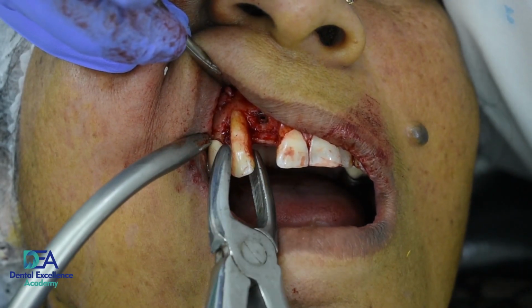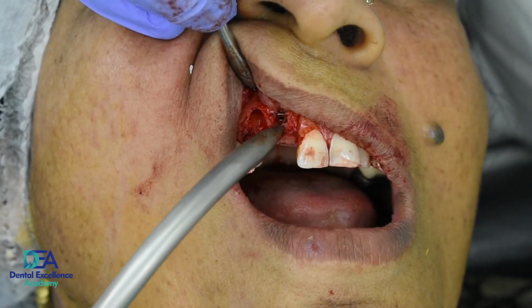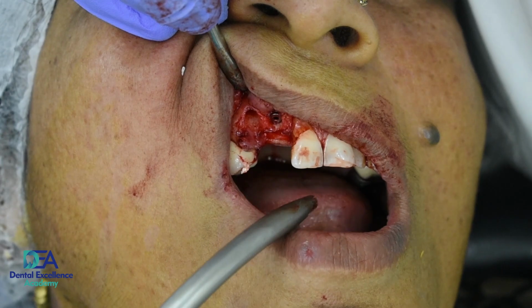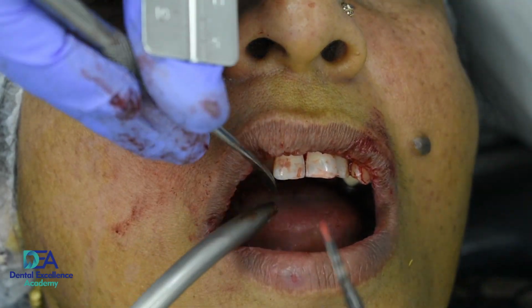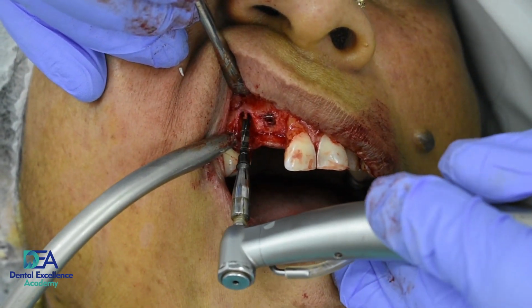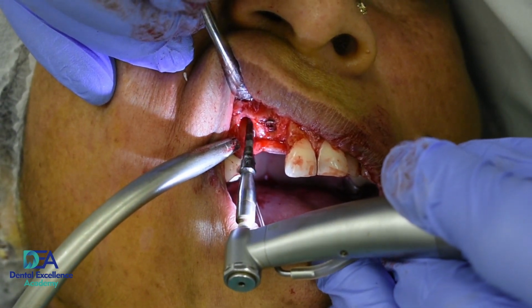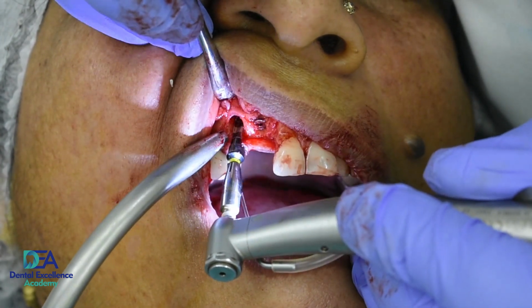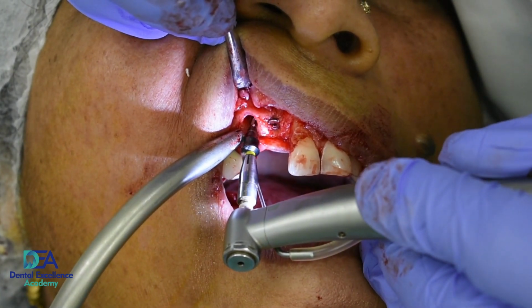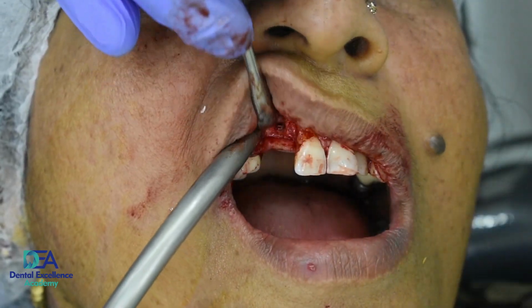So now I'm extracting 1 3, that is the upper right canine. Here also we have a bone loss on the buccal aspect. In immediate extraction cases, you have a predetermined path, but in some cases you have to change the path. So right now I am changing the direction a bit because the canine was drifted mesially, so I am correcting the direction.